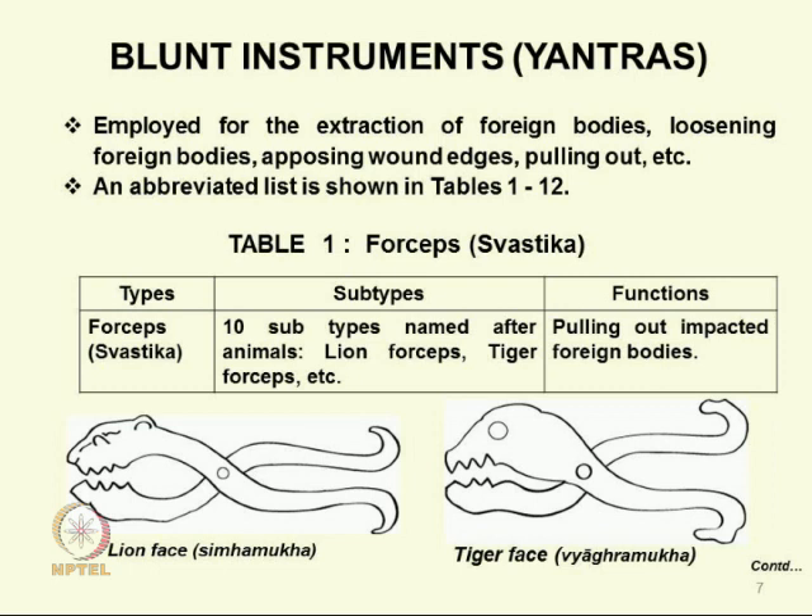Here you can see the blunt instruments. I have tried to group these as best as I could. They are used essentially for extraction of foreign bodies in various parts of the body, loosening of foreign bodies if they are impacted inside, apposing the edges of wounds before suturing, pulling out things, and so on. The first group of forceps — there are 10 of them — is grouped under swastika, with 10 subtypes.